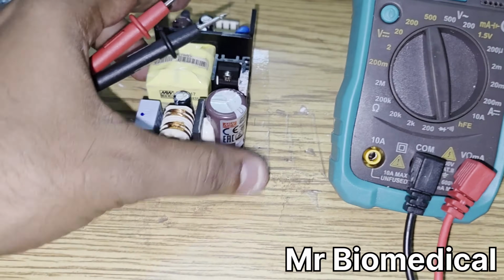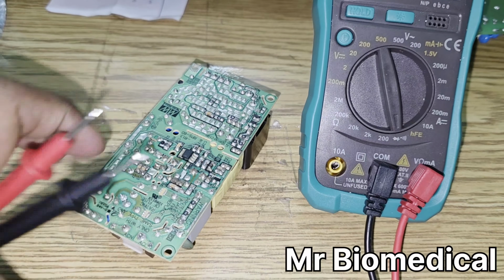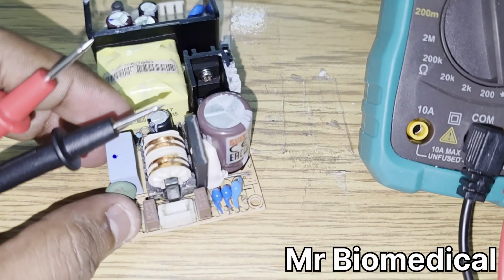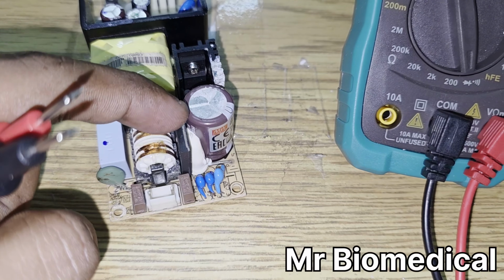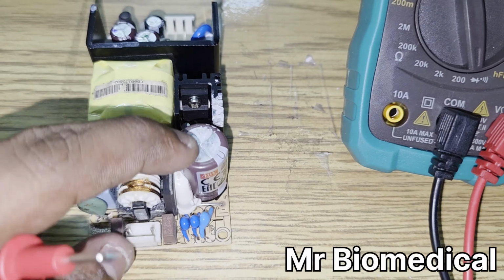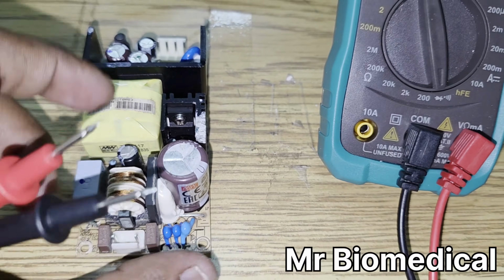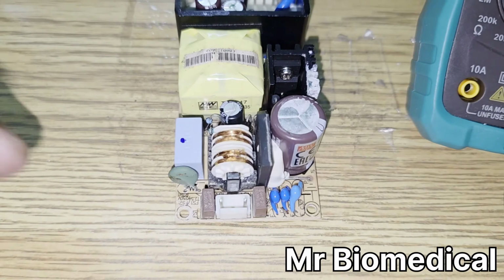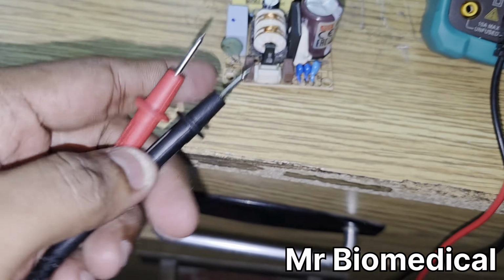So what I have to do is check the fuse first, and then I will go with the inductor, capacitor, bridge rectifier, and the transistor. Before approaching the SMPS, we have to know whether the board is shorted in the primary side.